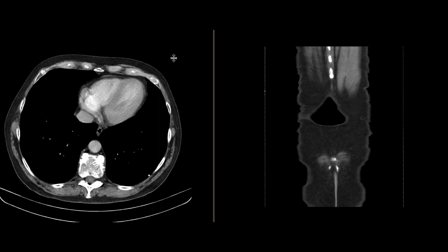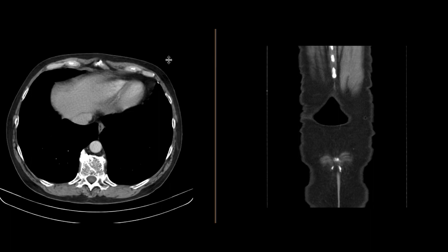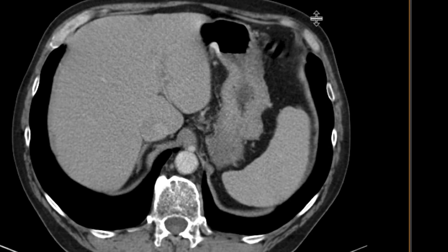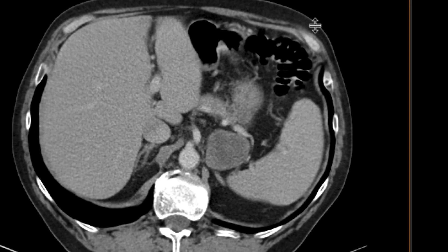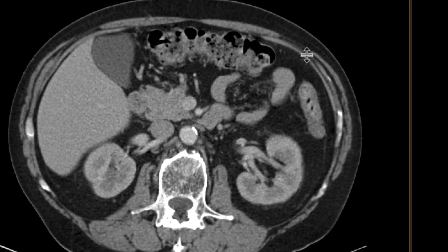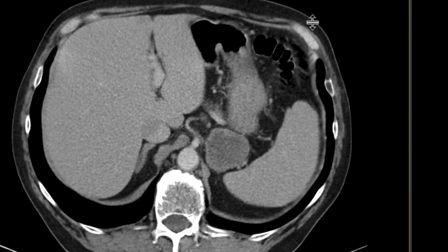This is a patient who came in with left upper quadrant pain and got a CT scan with intravenous contrast. As you scroll downwards, we can see pretty immediately that there certainly is an abnormality in the left upper quadrant.